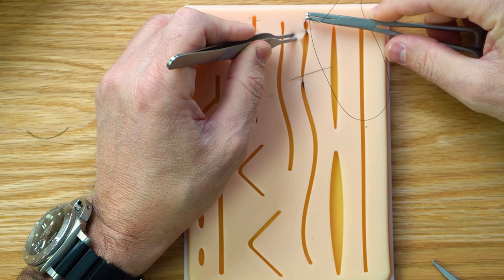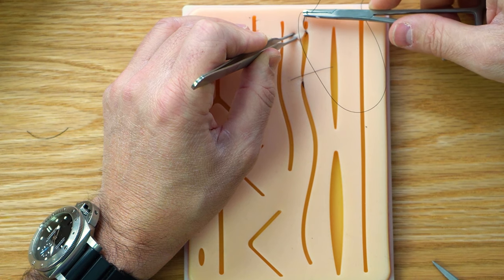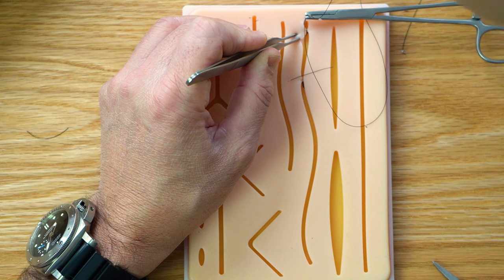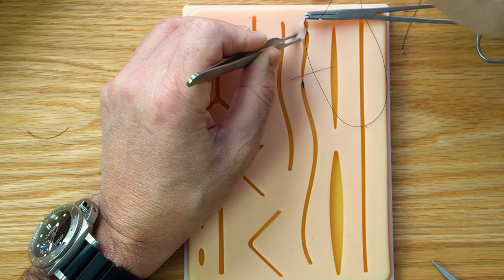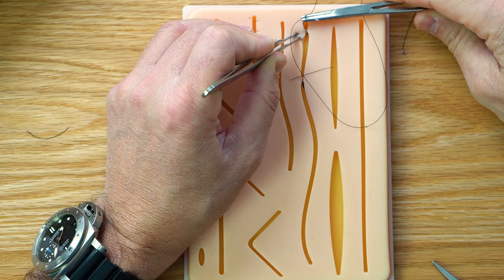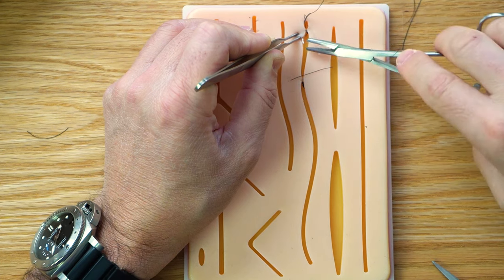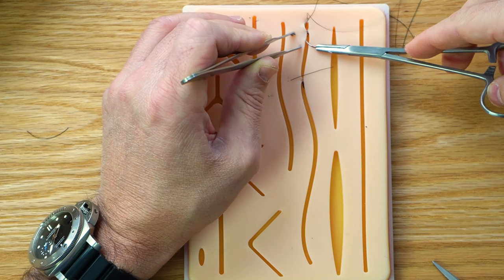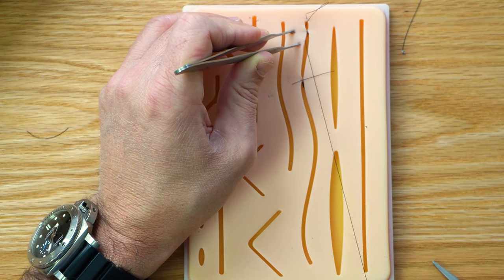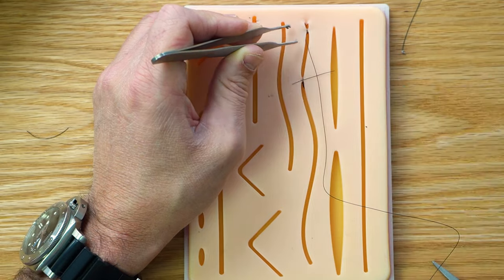It goes in, I pull this back a little bit, and then instead of making an arc that way, it's kind of making an arc, but you're pulling the tissue out, so when you let it go, it does make that arc, okay? Does that make sense? And then when I come out this way, I don't know if we can see it, but that suture has made an arc this way.